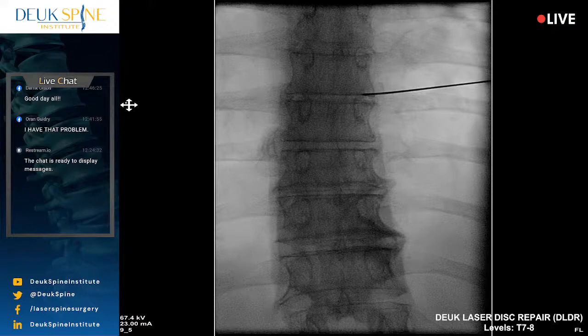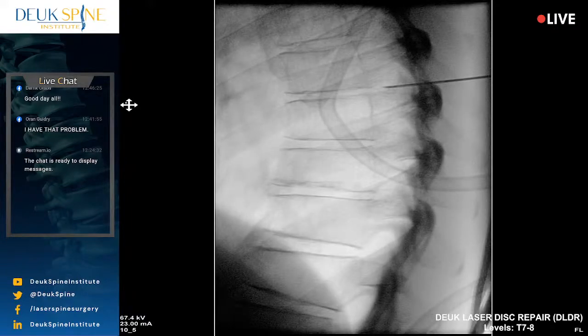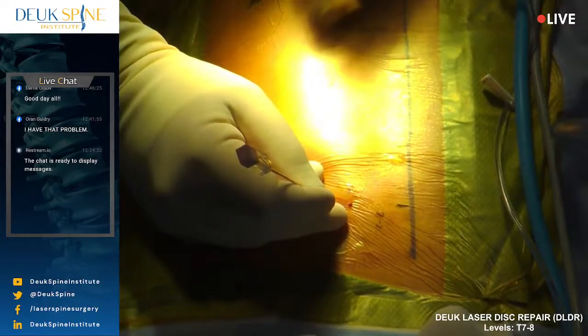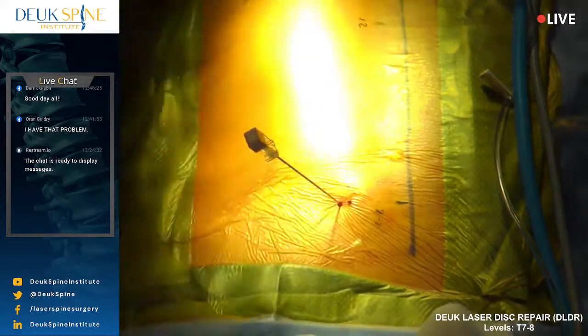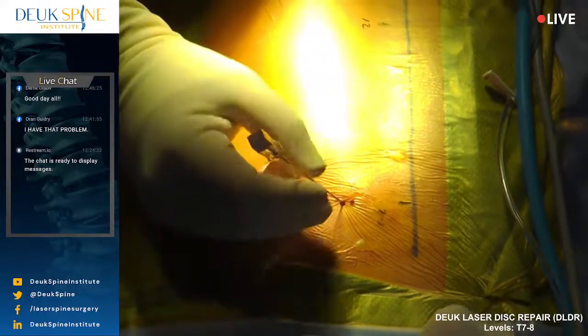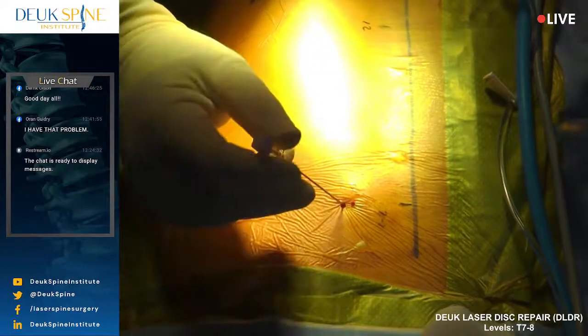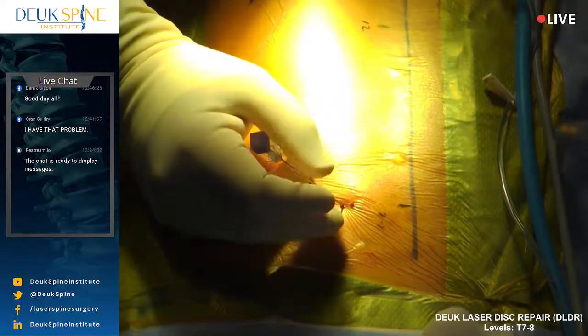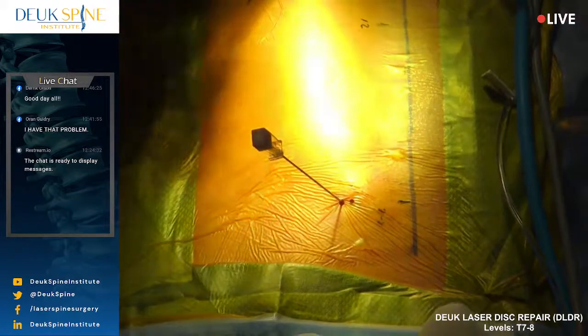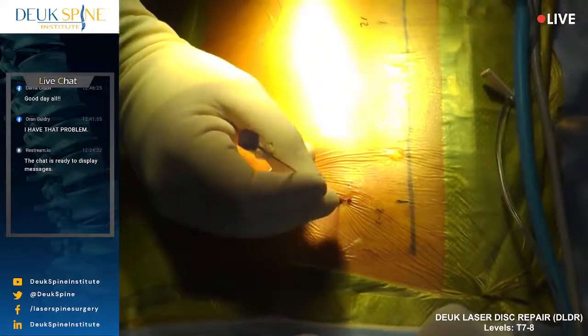So everything is going well. We're well away from the lung fields. Are you comfy? All right, just about ready to put you to sleep in just a few minutes. And I'm just moving very nice and slow and carefully. About to enter the disc. You're going to love watching this, I think, when you're done. Blood pressure is good. See if we can bring it down a little bit. Are you comfy, sir? Yeah? All right.